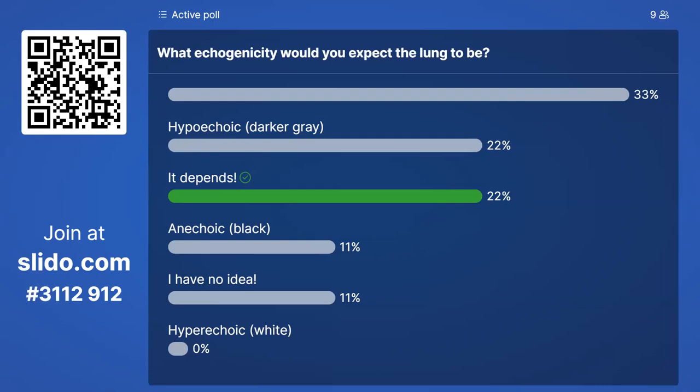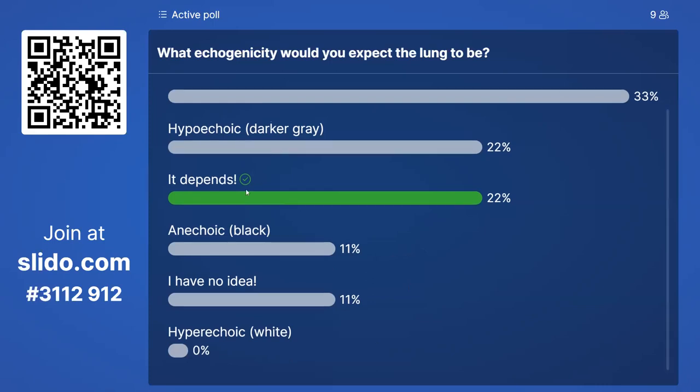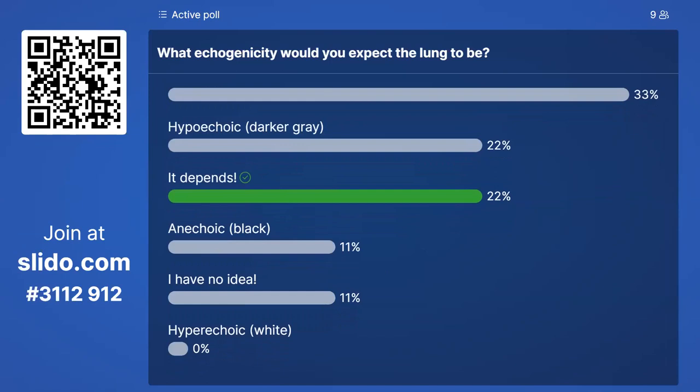So then you'll ask why. Your lung should be full of air when it's normal. So on the screen, you may not see anything at all. It may show up looking anechoic, but it's not fluid. However, if your lung is full of junk, sputum, pneumonia, air is not getting to those alveoli. And so what happens is it turns into a piece of steak.